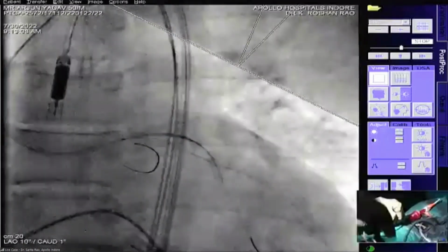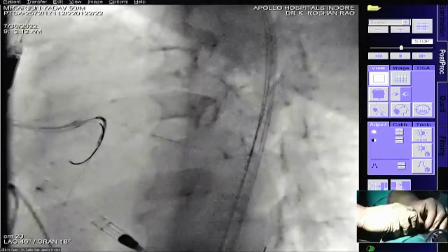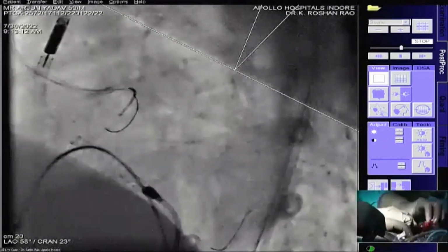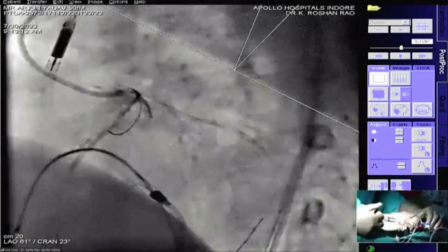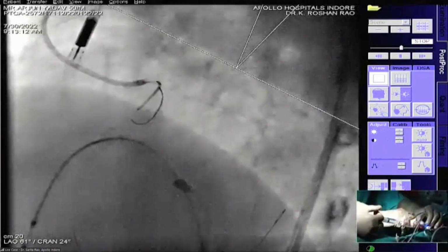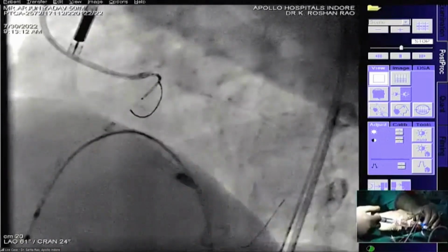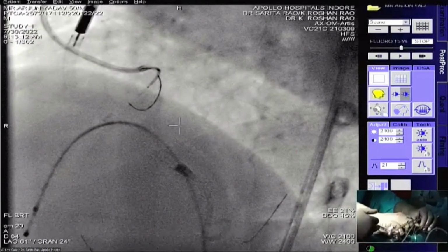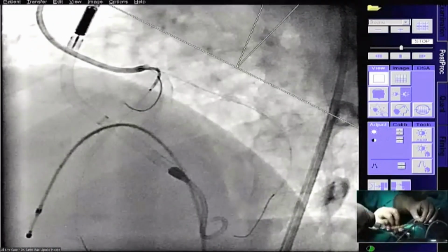Yes. Actually, the point which you mentioned, Dr. Ramesh, is very relevant in times where you do crossover stenting. The differential expansion limits are written on each stent pack. That should be kept in mind. What you mentioned is very right. 2.5 cannot go up too high. 3.5 platforms are okay going up. Especially, I think Resolute Onyx has this left main study, which did a lot of work like this, and the higher ones can go up to 5.6 as the limit.